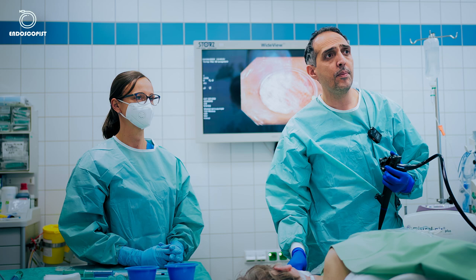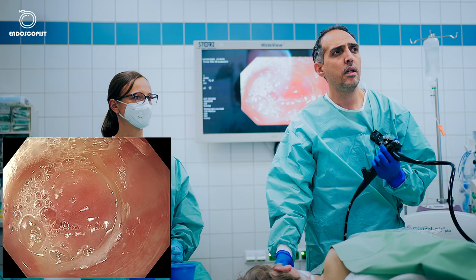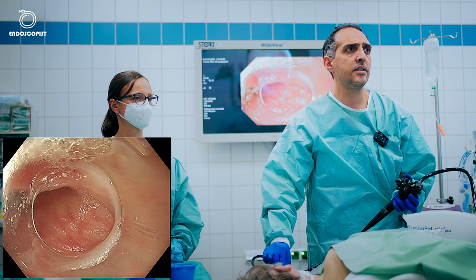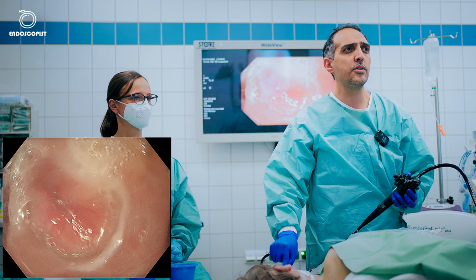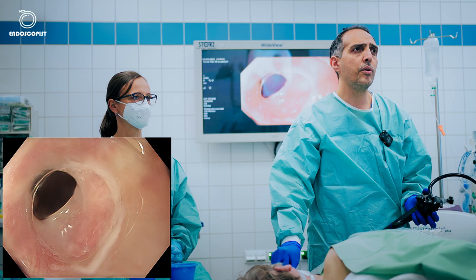Let's get started. We'll begin by performing upper endoscopy to evaluate the Zenker's diverticulum. The patient is intubated. You have to be very careful when observing Zenker's diverticulum — you must locate the esophageal lumen first. As you can see, here is the esophageal lumen. I'll push gently and we'll go through the upper esophageal sphincter into the lumen.